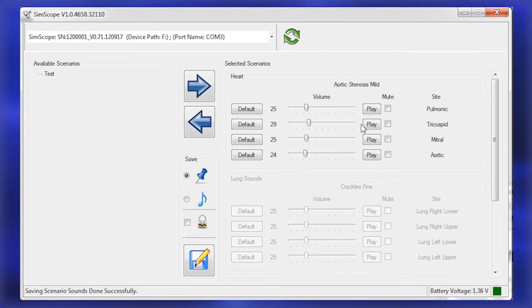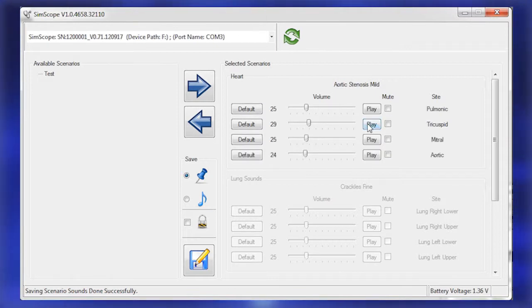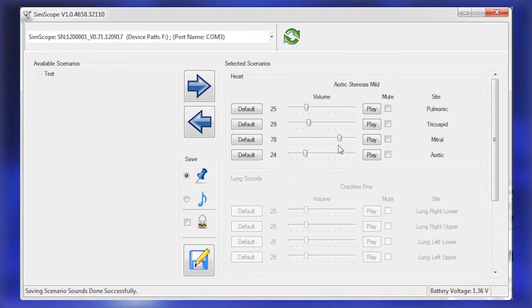If desired, listen to the newly inserted scenario live through the SimScope and adjust the volume via the slide controls located on the screen.